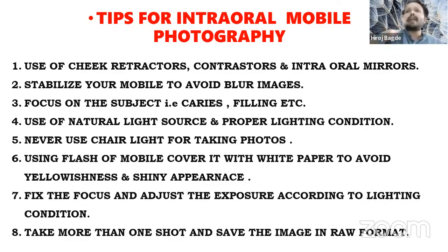Because the f-stop number of the camera is very small in nature, with a range of around 1 to 2, we will definitely have less area in focus. So keep that in mind always. Whichever caries you are focusing on by use of the macros, we are going to focus on that area. That area has to be selected first, and then we have to plan our image.